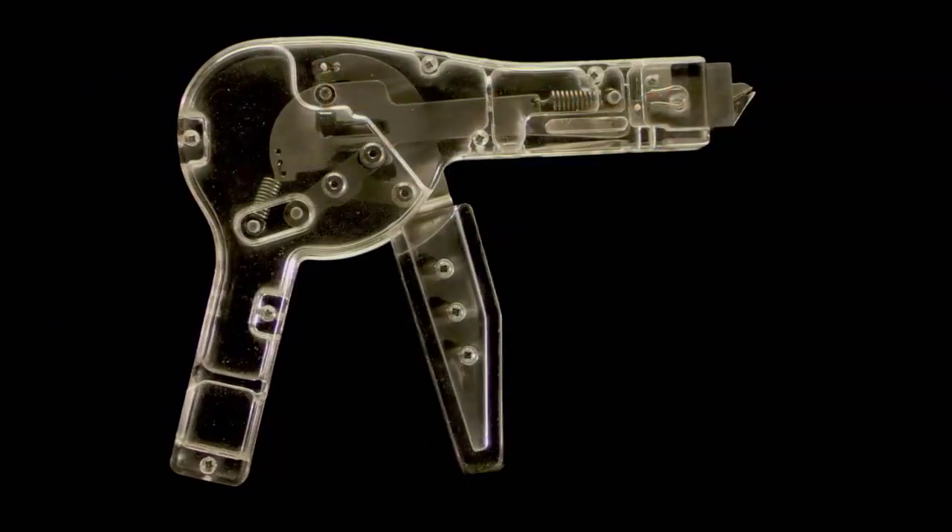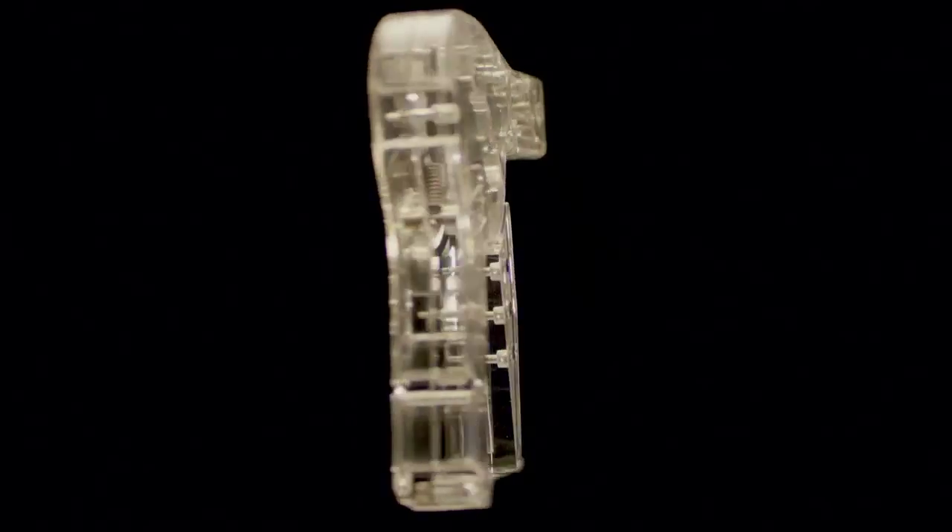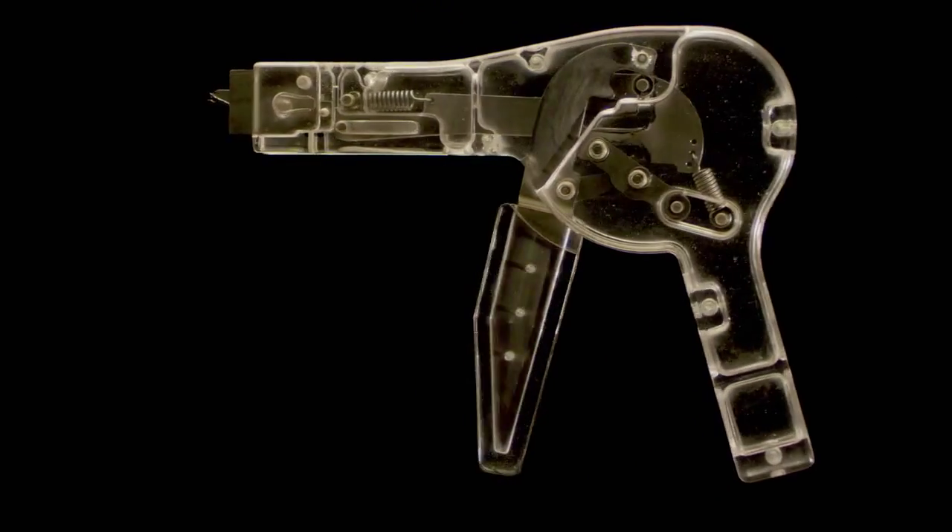This is the SSR, the first device to make the removal of surgical staples sterile and efficient. Wait, what?